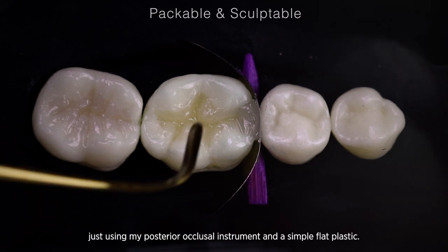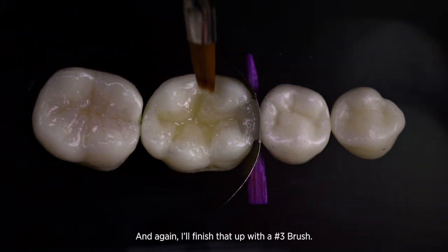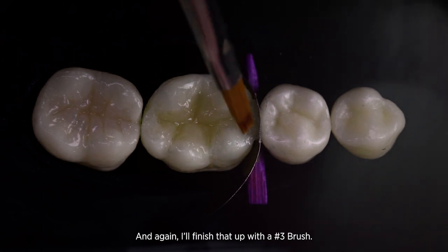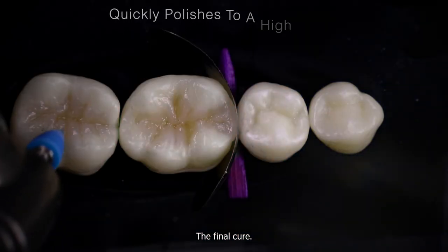I'm just using my posterior occlusal instrument and a simple flat plastic, and again I'll finish that up with a number three brush. The way this material adapts to the tooth is really fantastic. Then I'll do the final cure before moving on to polish.